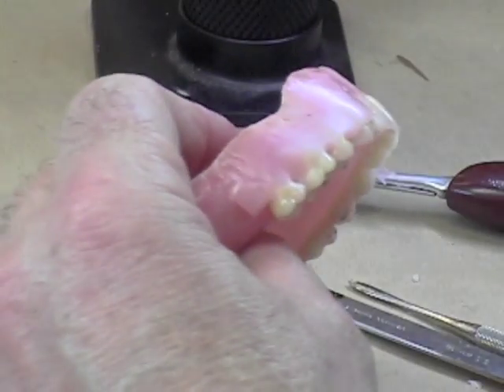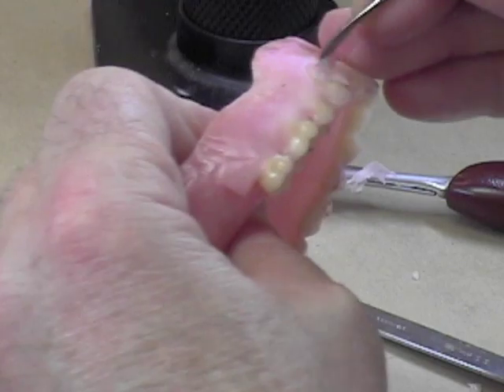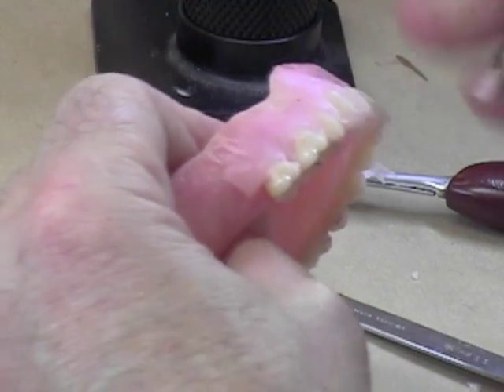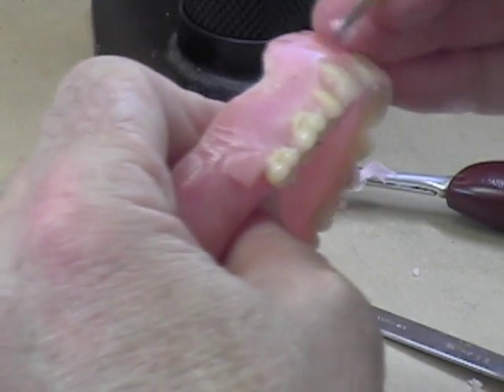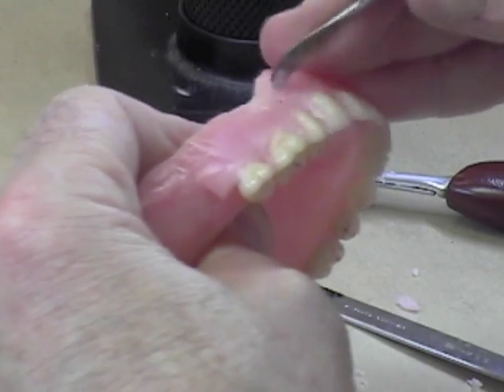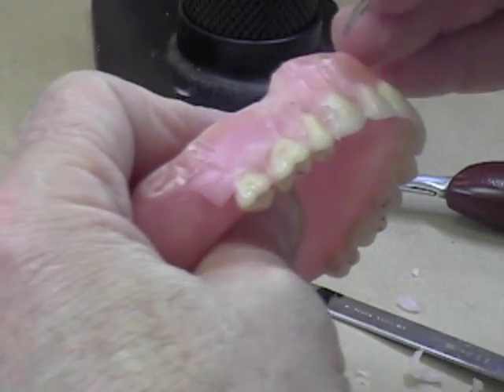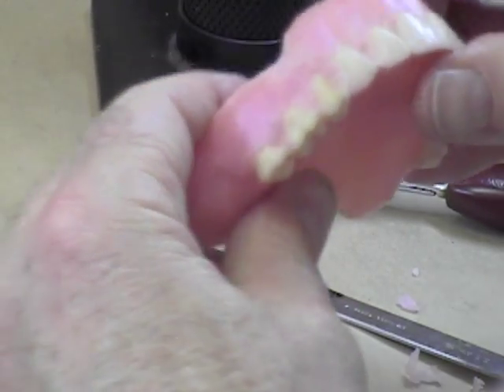I'm going to take the large portion of the number 7 wax spatula and, while this is still relatively soft, take away a lot of the wax all at once from these teeth and try to get close to the cervical portion of the tooth. If you watch different technicians, you'll find they all have a slightly different way of waxing up the denture — one way isn't necessarily better than another, as long as when you're finished you get to the appearance you want. Make some concavities in between where the roots would be on the tooth.